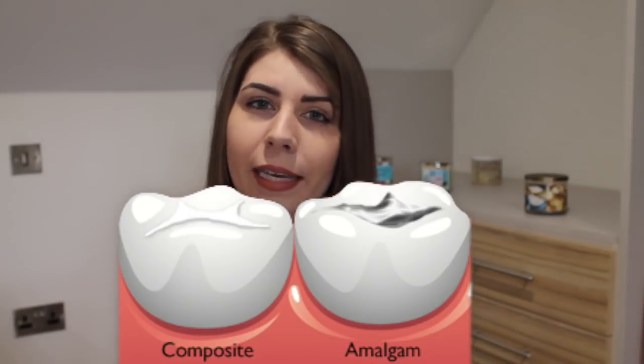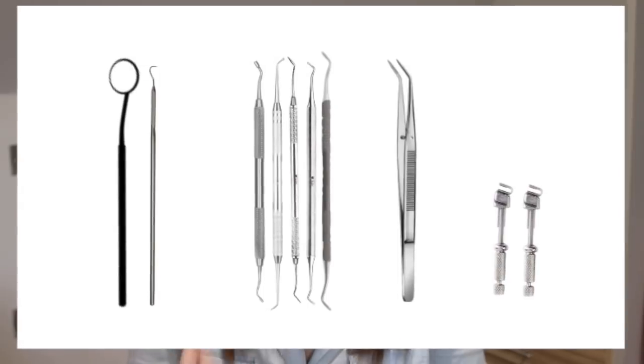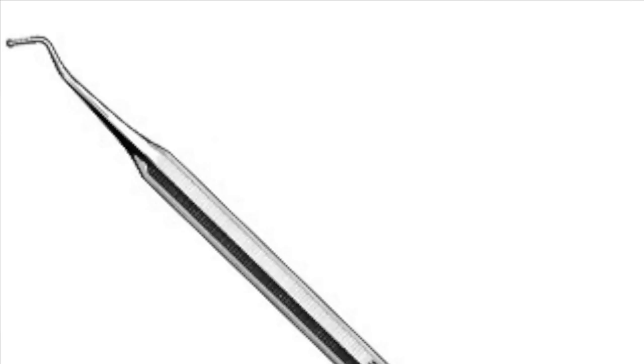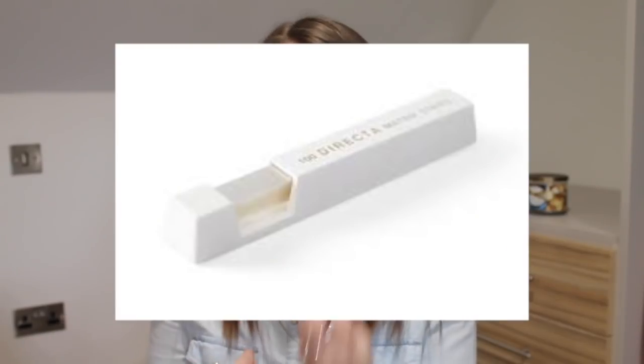There are two main filling materials: composite (white filling) and amalgam (metal filling). Every practice will set up a filling tray slightly differently, but the basics are: a mirror and probe, your three-in-one tip, an amalgam packer, a ball burnisher, sometimes a carver, an excavator, a flat plastic, tweezers, and maybe some wide and narrow matrix bands or a clear matrix strip.